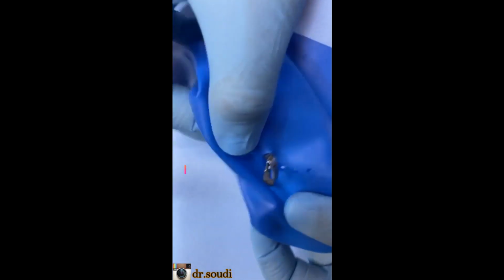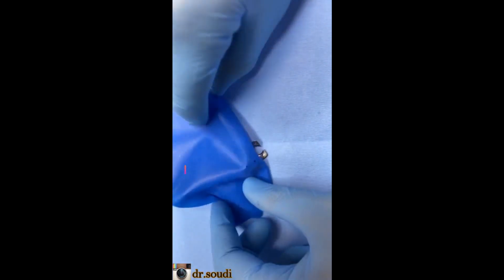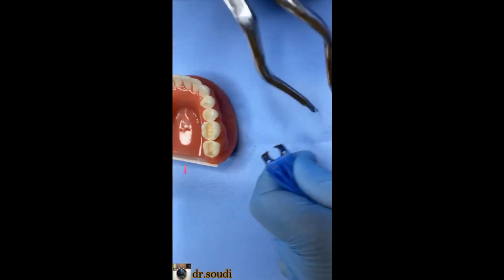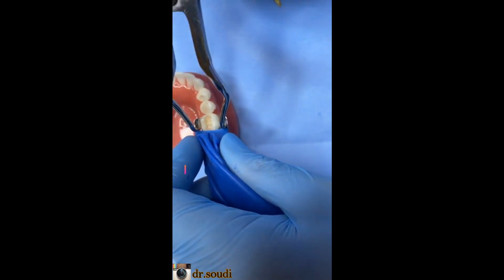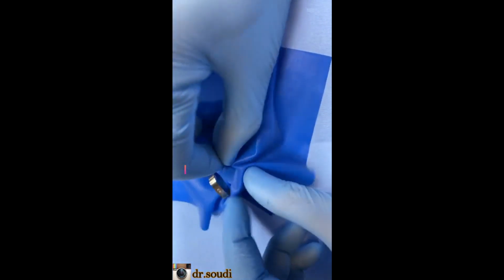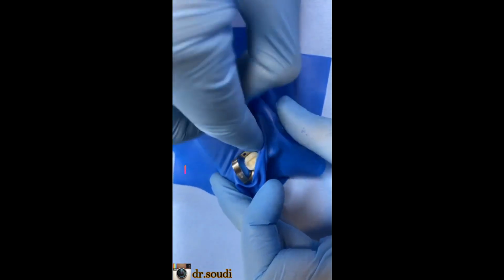How will I place it? Like this. I have the clamp here, I have only the bow. I will elevate the sheet like this on my hand. I have the clamp here from downward. I will place my forceps here, place it on the tooth like this and leave it. Then easily, smoothly you can pass your sheet under the clamp like this.